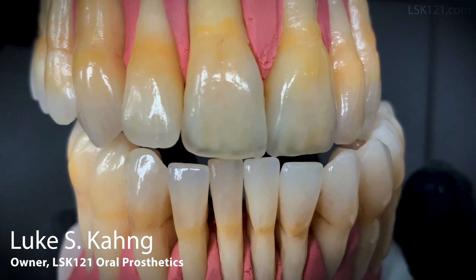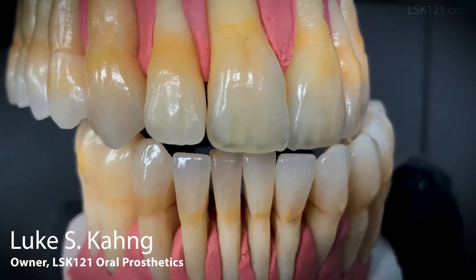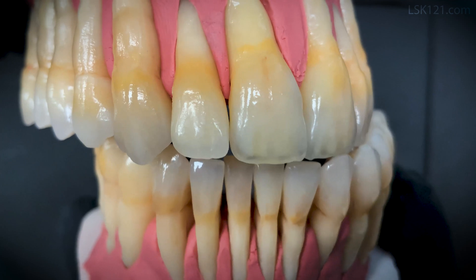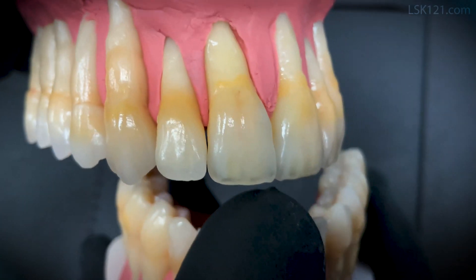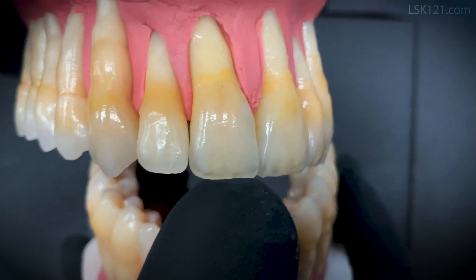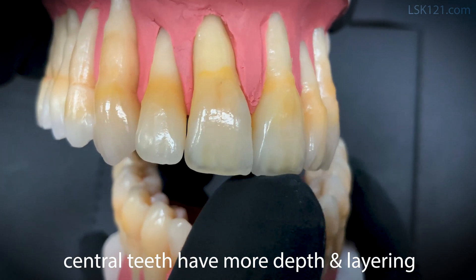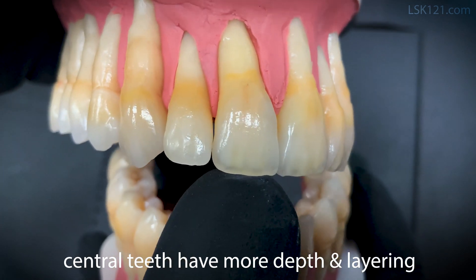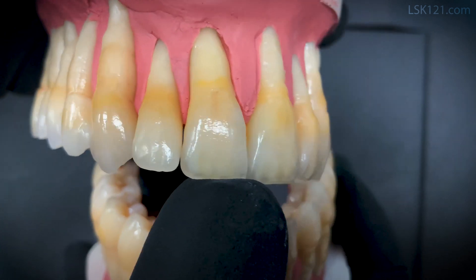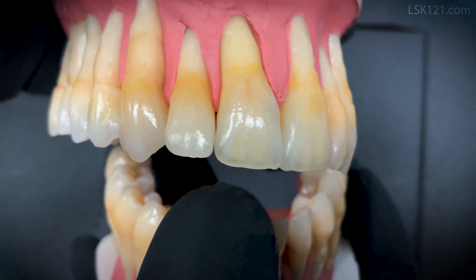This is an indication for full mouth restorations. See how teeth 8 and 9 have more depth and layering inside, trying to create the mamelon halo in transparency. So teeth 8 and 9 mimic natural teeth.